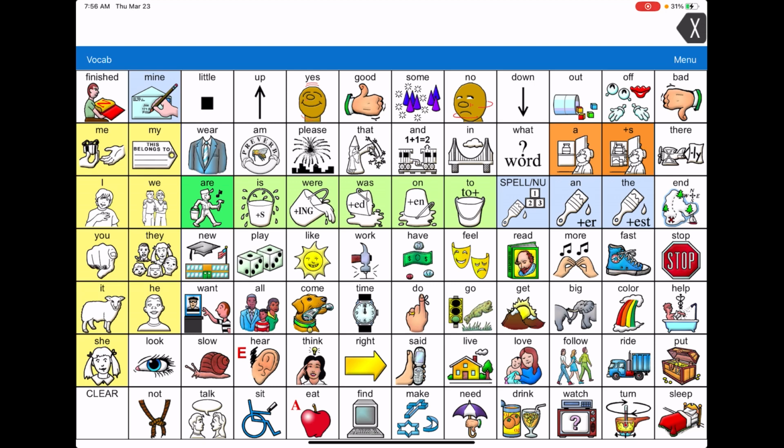Core words are used by everyone across all contexts, and the developers of LAMP wanted to give access to that vocabulary on a quick basis.